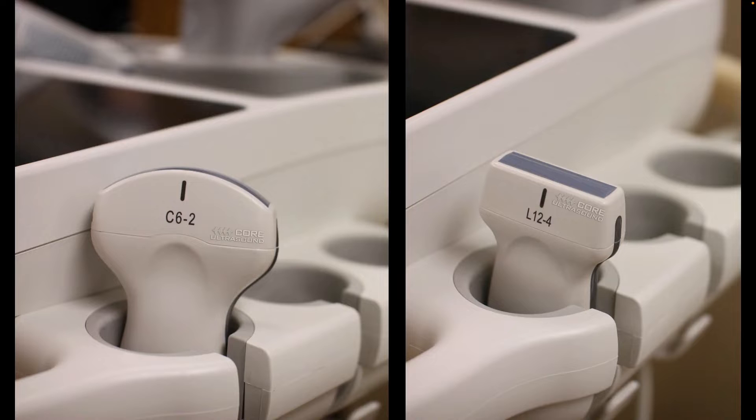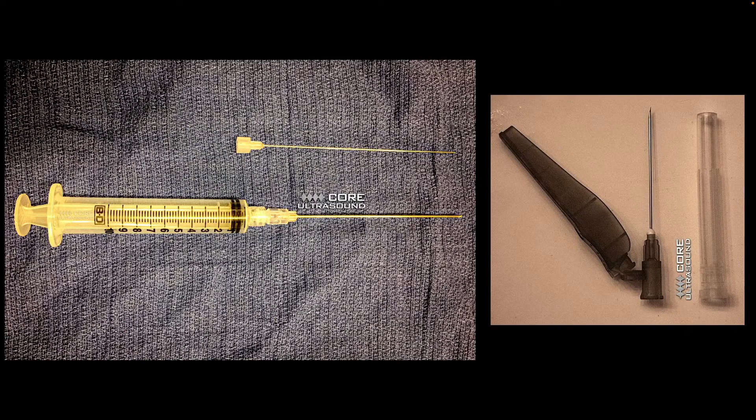With regards to the probes of choice, generally your linear transducer is going to be your probe of choice. But if you have an aspiration or injection where you're having to go a bit deeper than around four to five centimeters, the curvilinear transducer is going to give you a bit more depth to reach that.